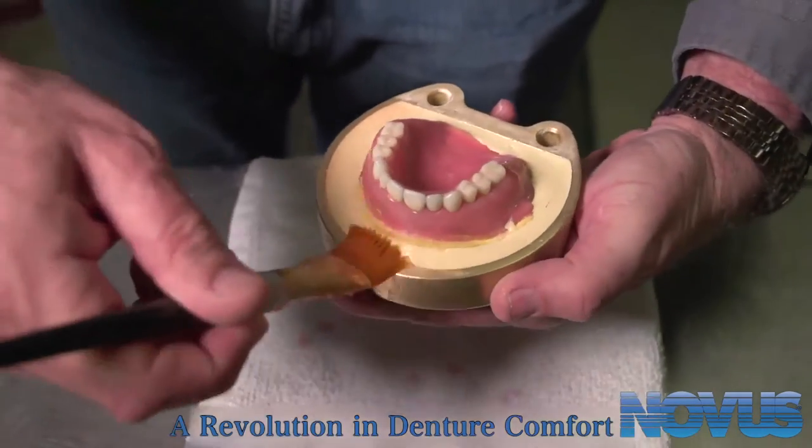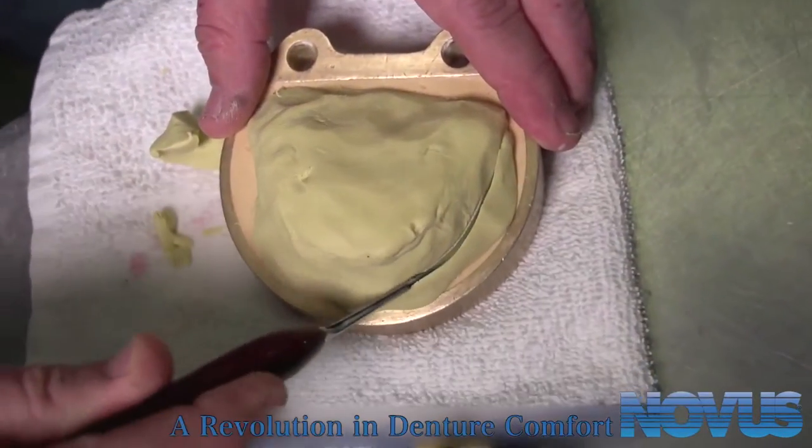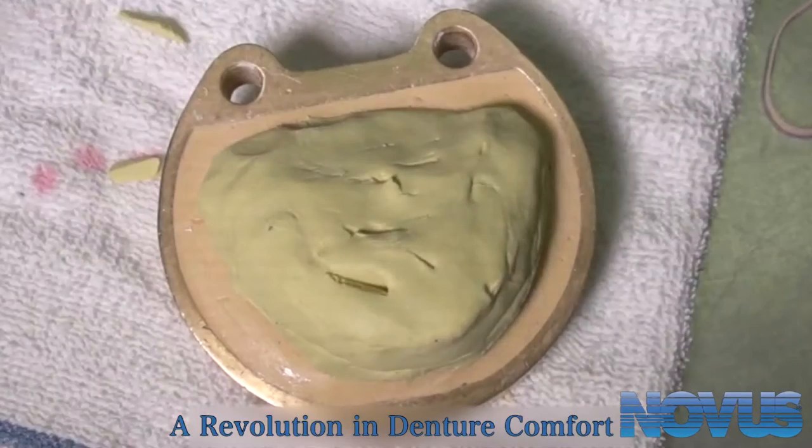During the investment process, use a PVS material around the entire denture and over the teeth to facilitate easy removal from the flask. If processing a new denture, PVS putty is not necessary.